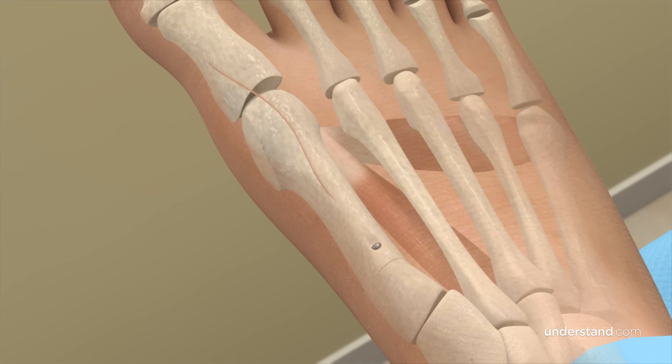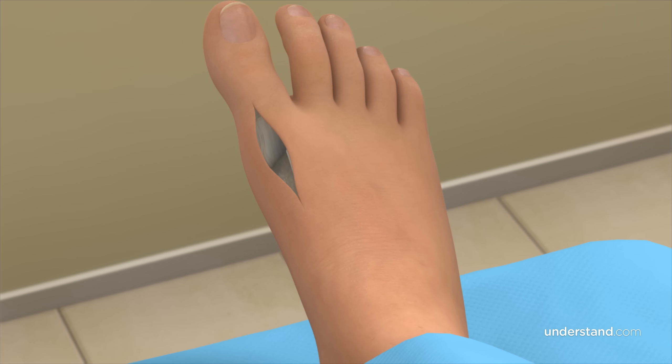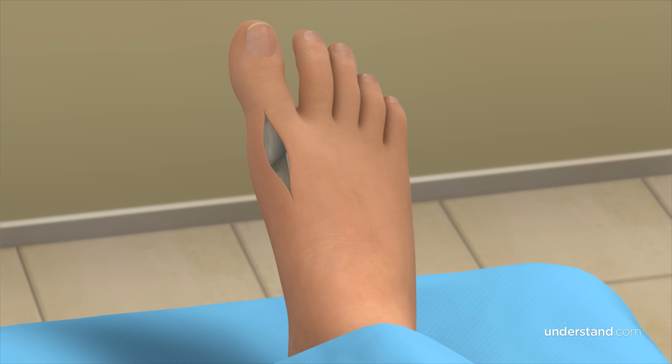Additionally, loose tendons or ligaments often need to be shortened, or tight tendons or ligaments need to be lengthened by cutting and repositioning them. For those who have had previous bunion surgery, any damaged portion of the joint may need to be removed. Once all repairs and adjustments have been made, the incision will be closed with sutures and a bandage will be wrapped around your foot.